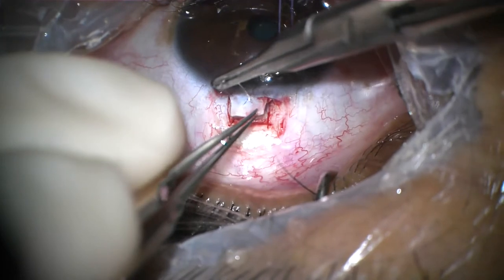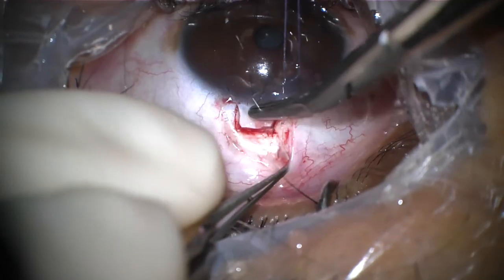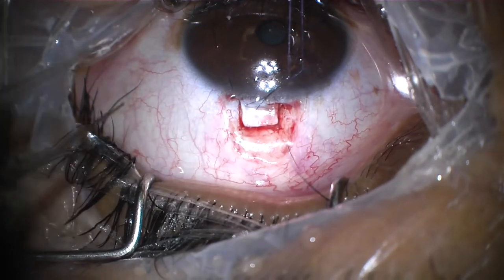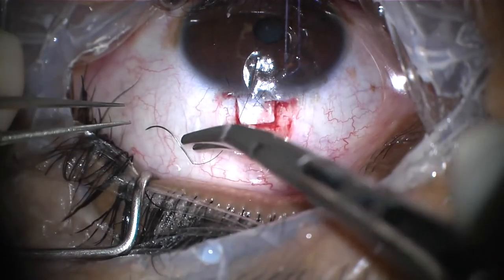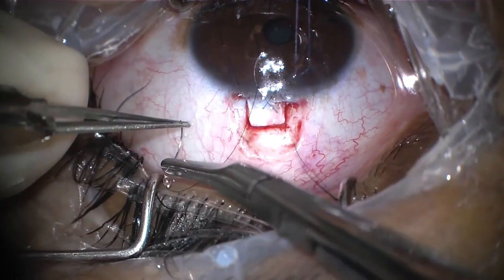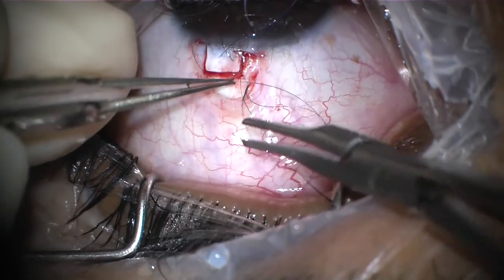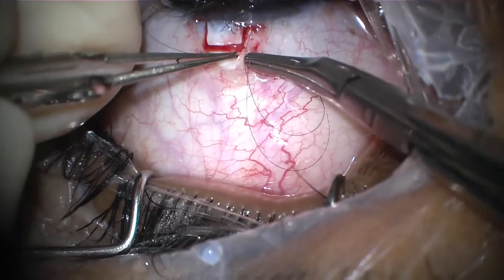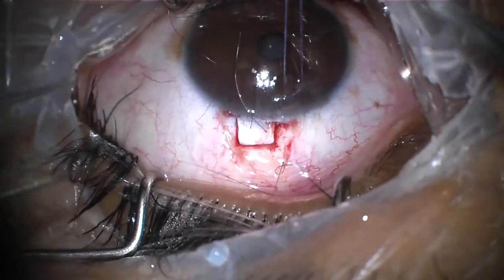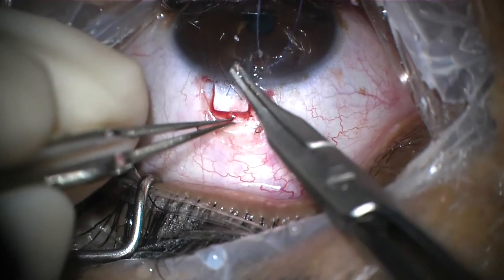The same suture technique is applied at the other side of the flap — from the scleral arm into clear cornea, which creates the scleral loop. Then again, another pass through the cornea to create another loop on the cornea.